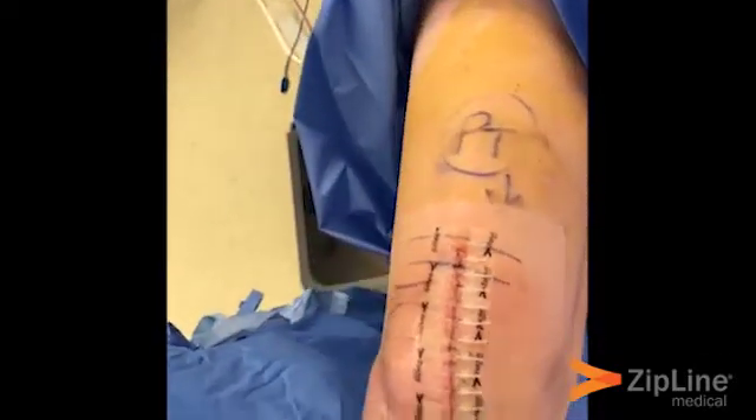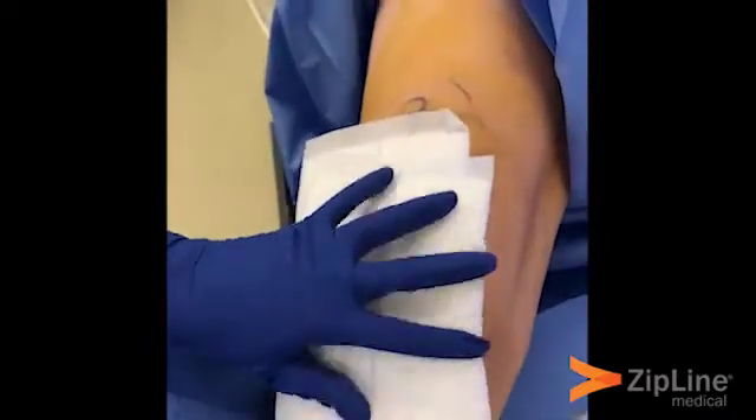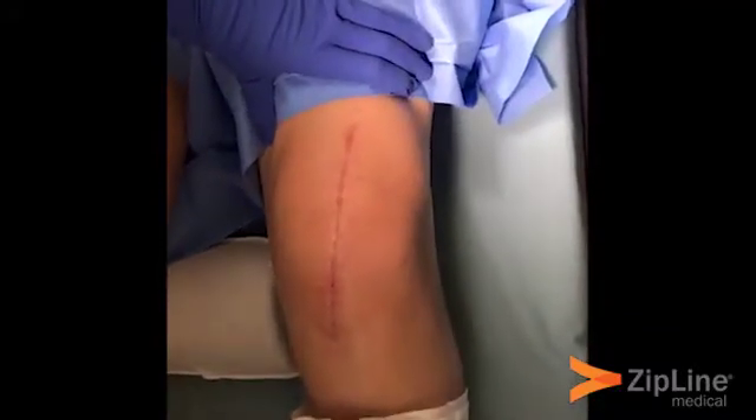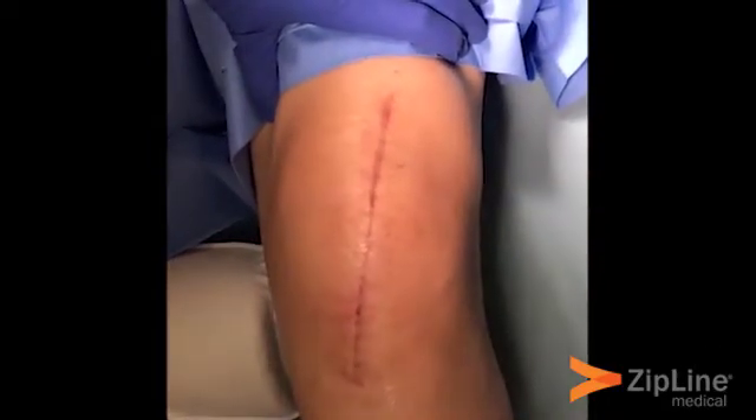Looking over here, the patient's contralateral left knee was replaced about six weeks ago and closed with a Zipline — and that's what the incision looks like at six weeks post-op.